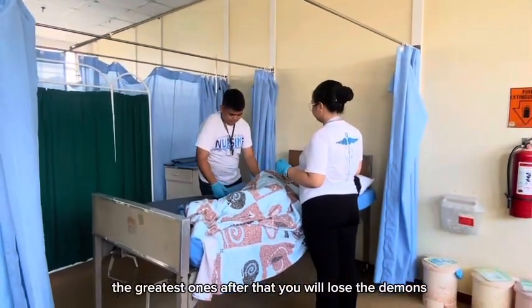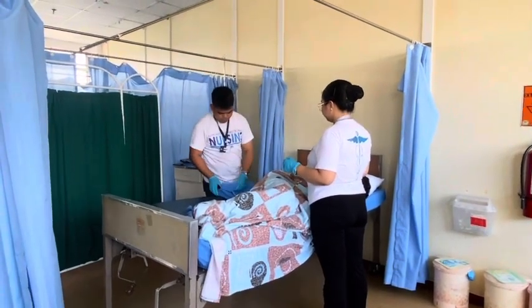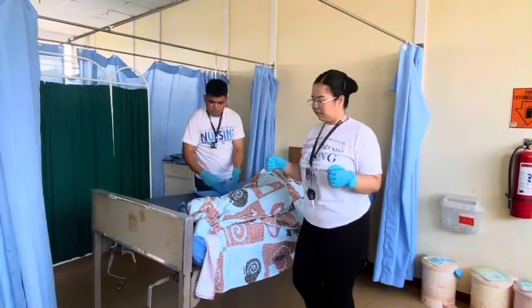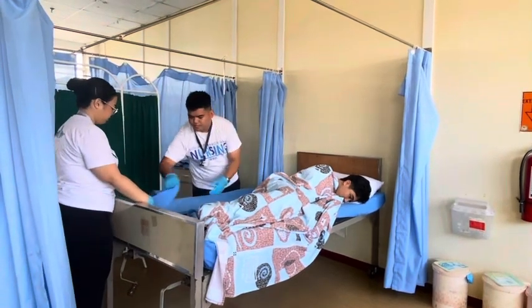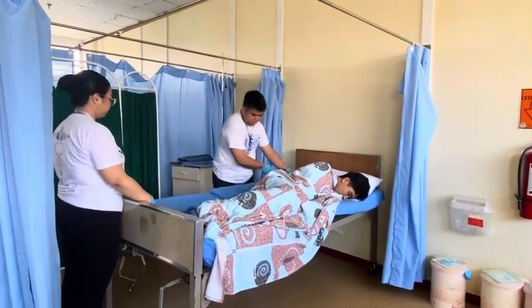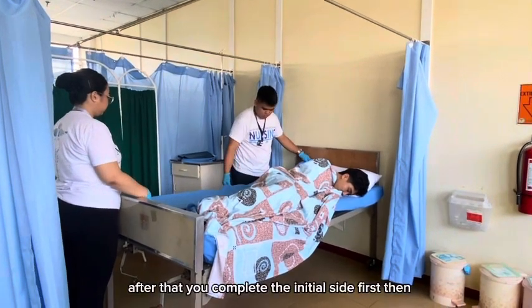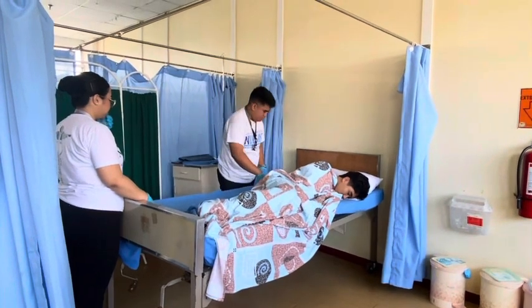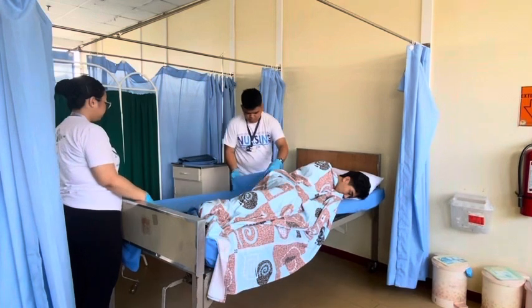After that, you will loosen linens, fan fold towards bed center, keeping the top sheet for patient privacy. Turn the patient to the side facing away, synchronously holding buttocks and shoulders, following proper body positioning and proper body mechanics. After that, you will complete the initial side first, then return to the other side to finish later on since the patient is still on that side.